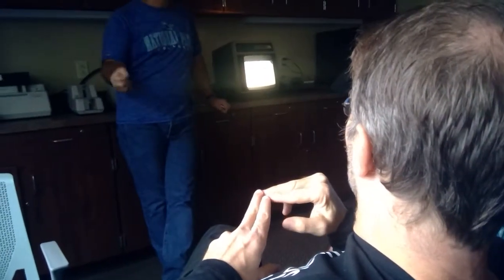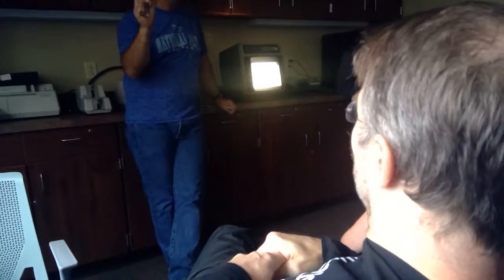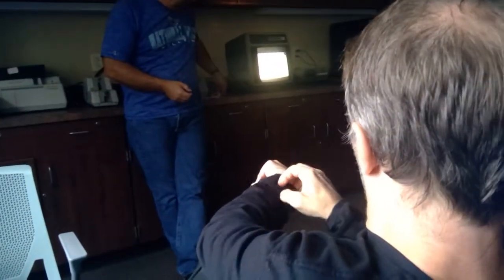So if you're a brand new tech and you're worried that you're doing something wrong, what is something you could do to differentiate yeast from red blood cells? Oh, hemolyze the red blood cells. You add the acid. Very good. You add a real dilute acid, like maybe a 3% acetic acid solution. The red blood cells will lyse. Acid will lyse the red blood cells and the yeast will stay there. So if you add the acid and everything goes away, well, it was red blood cells, right? Not all yeast produces hyphae, so if it's not budding, it's really hard to tell from red blood cells.